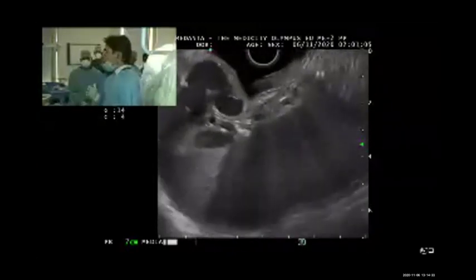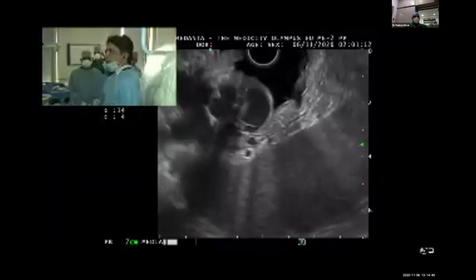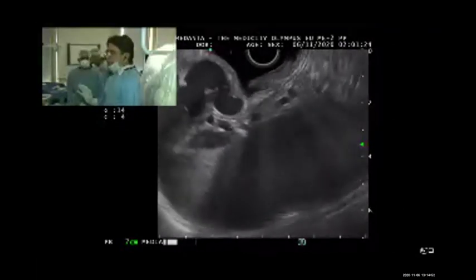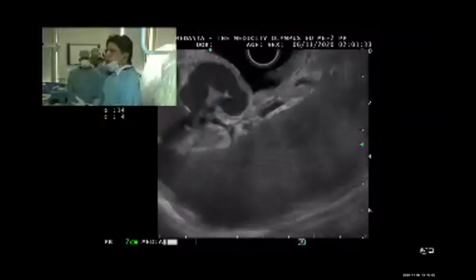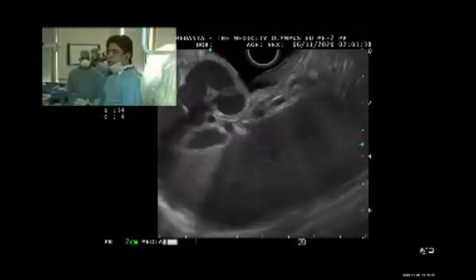We don't use it because the needle size and the length of the endoscopic needle for the fundal varix is very small. For EUS, I think it makes sense to save that needle. So in routine endoscopy practice, we don't use lipiodol. I think that message has to go very clear. In EUS, we will show fluoroscopically when we inject the lipiodol, as an advantage of opacity. Lipiodol is an advantage because it increases the coagulation time, the needle won't get blocked, and your procedure is completed. So only in EUS we use lipiodol; in endoscopy we don't.